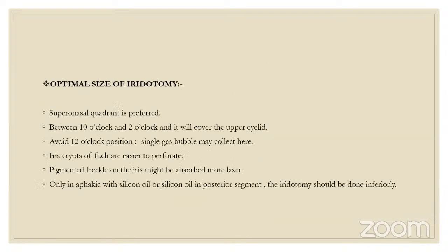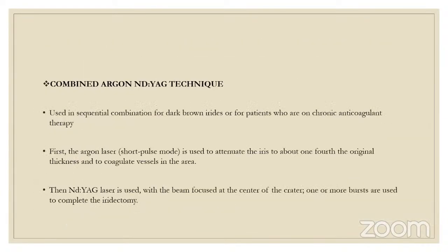Combination of Argon laser and YAG laser is definitely given in the scientific literature, because Argon laser is majorly followed on the eastern side. So even ALT and SLT, I think the eyes cannot take it, and the study is also being done in Indian eyes. Somehow it has lacked popularity in India.